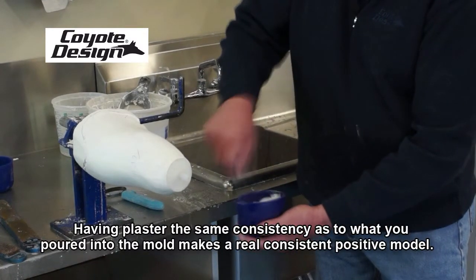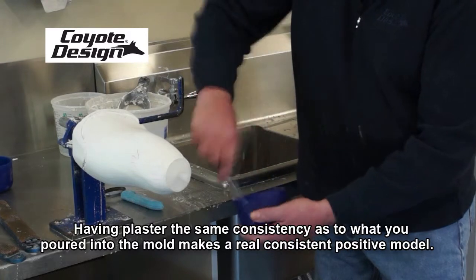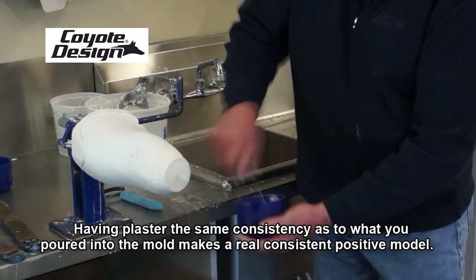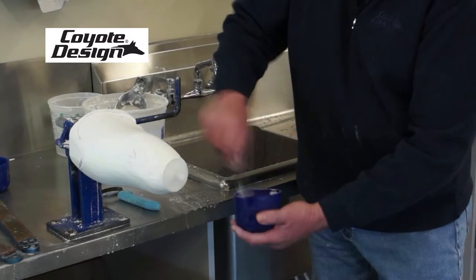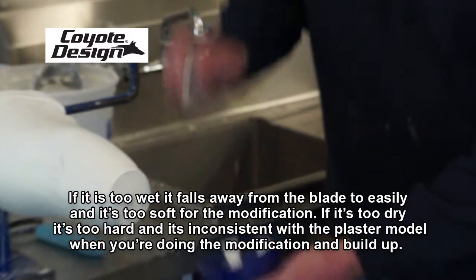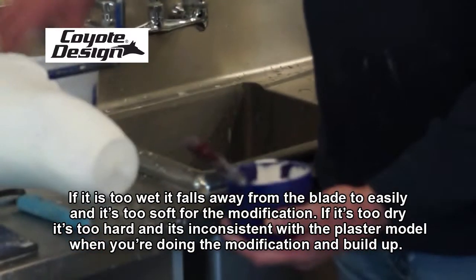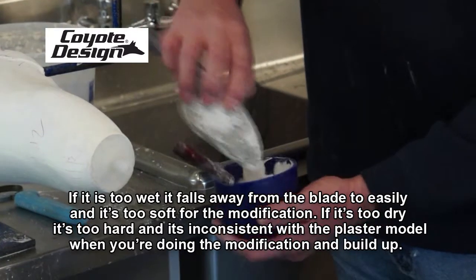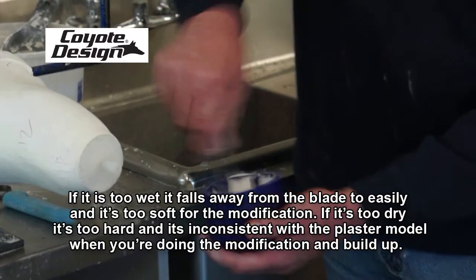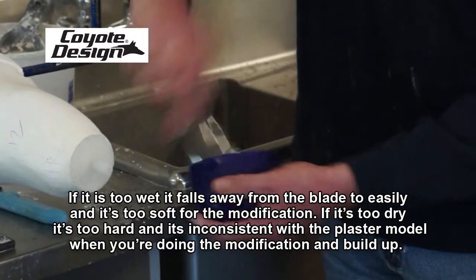Having the plaster at the same consistency as what you've poured into the mold creates a real consistent positive model. We're looking for a consistency that's not too dry and not too wet. If it's too wet, it falls away from the blade too easily and is too soft for modification. If it's too dry, it's too hard and inconsistent with the plaster model when doing a modification and buildup.